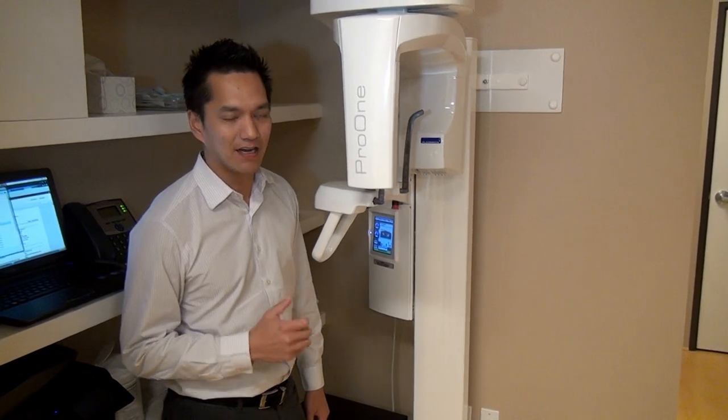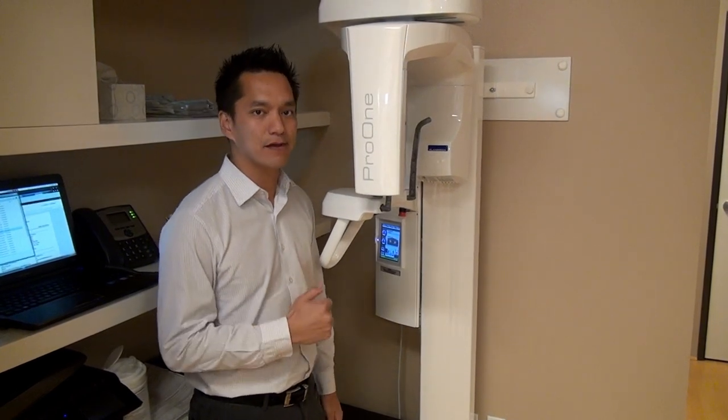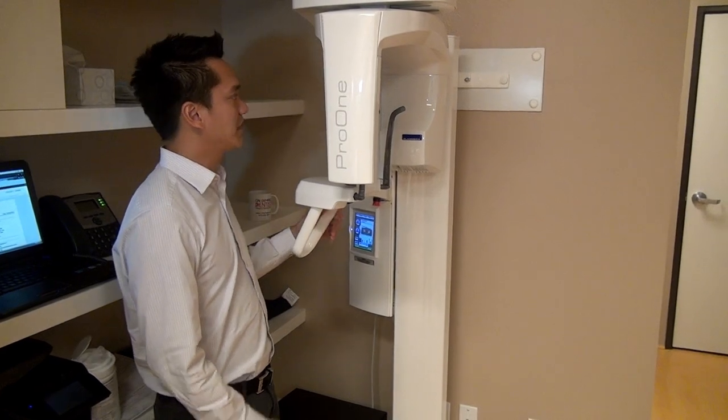I'm Dr. Marvin on BigDiastema.com. I'm going to show you this really brand new Planmeca Pro 1 Panoramic X-Ray. This is for our brand new office. It's a Pro 1, very slim.